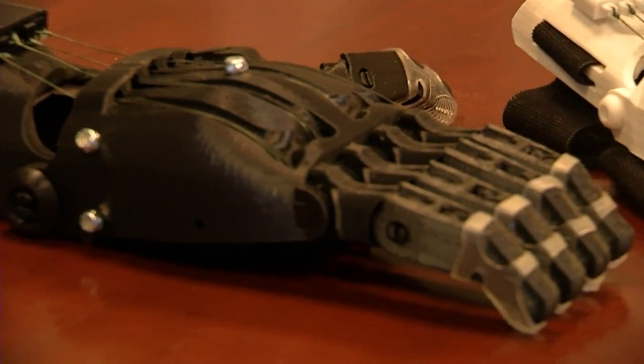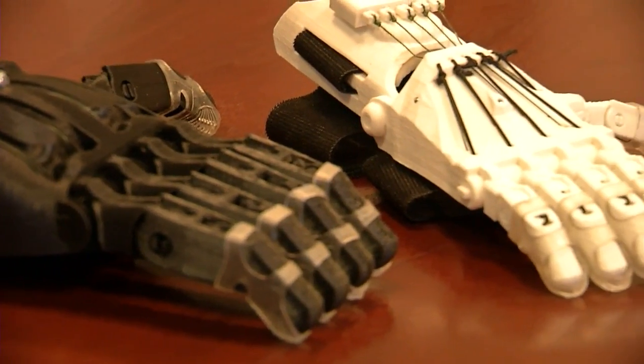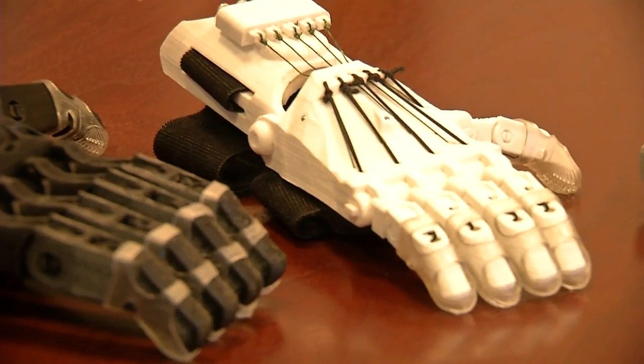They would send that cast out to a company that would fabricate the prosthesis, and sometimes it wouldn't fit properly and had to be sent back — a very long process that typically took two to three months. Now with a 3D printer we can rapidly print these things, and the turnaround is roughly a week to a week and a half. The hope is that in time we'll start working on myoelectric prosthetics to give even more functionality to the 3D printed prosthetics we're making here at Jacoby.